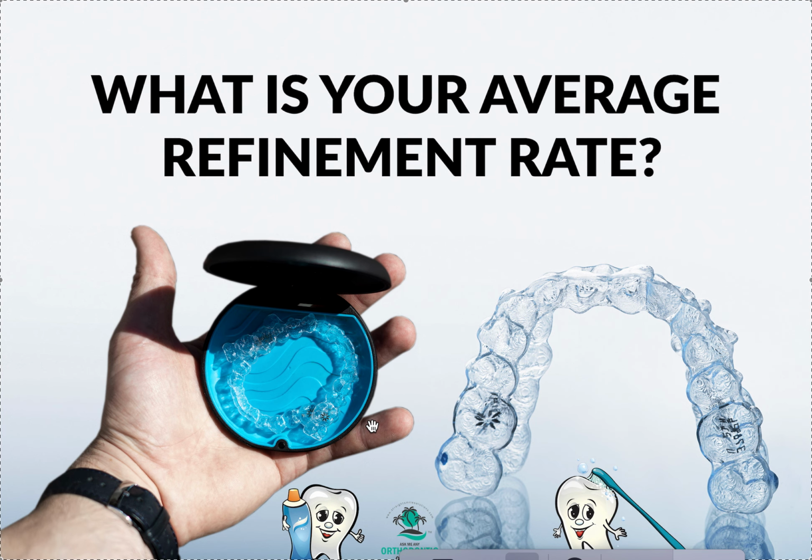There's always options, don't get me wrong. There's sometimes when that patient really wants short, sweet, even if it's not perfect, and that's fine. But you can't offer your patient that version unless you can offer your patient the understanding of what perfect is and show them perfect. And if you can't show them perfect, you have no business doing short and sloppy, because that is where you can get yourself in trouble, either with your insurance company or with your dental board. If the patient were to complain, it's going to get escalated to someone like me, who's going to look at that and say, that's a terrible Clincheck, okay?